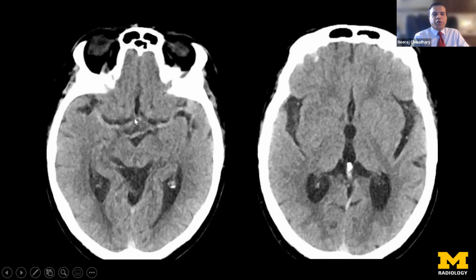And here is the anterior cerebral artery going out to the midline, getting blood supply to the paramidline portion of the cerebral hemispheres. On this second image here, you can see what is termed, you will hear that in publications, in textbooks, the insular dot sign. So here in the insula, or just overlying the insula, as I'm pointing out with the arrow, there is a hyperdense sign in the blood vessels. So suggestive of potential for clot in one of the branches of the middle cerebral artery, as the branch M1, which is called the horizontal branch, and then as it courses towards the insula, that is the second segment or the M2 segment. So this is a clot which is right at the junction of the M1 and M2 branches of the middle cerebral artery.